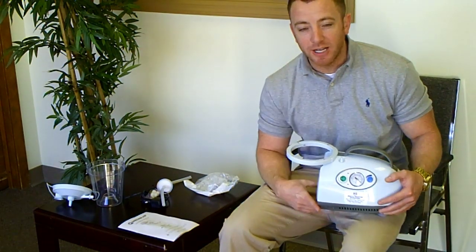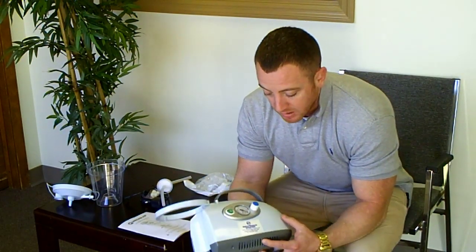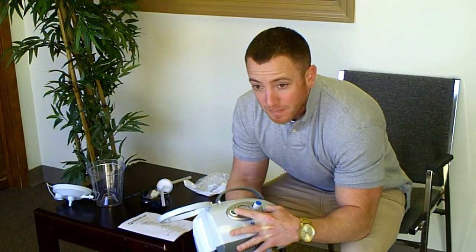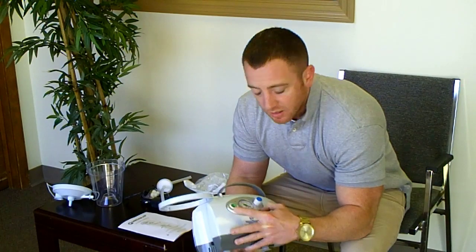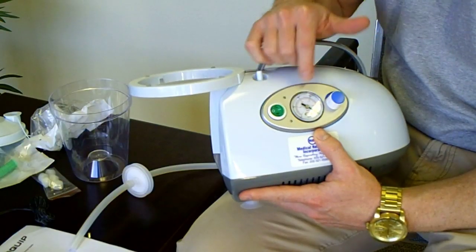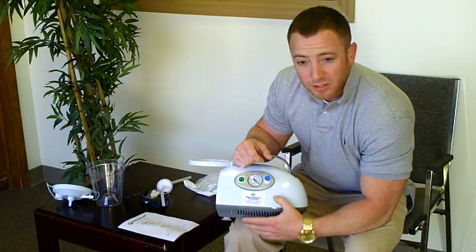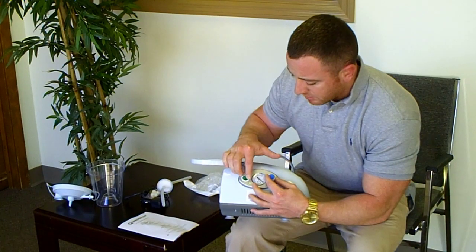Today we're going over a suction machine made by MedQuip. Right here's your on-off switch. To turn it on, you just simply turn it over like that. Right here's your suction gauge. The object of this is to clear any airway, to clear your respiratory airway.